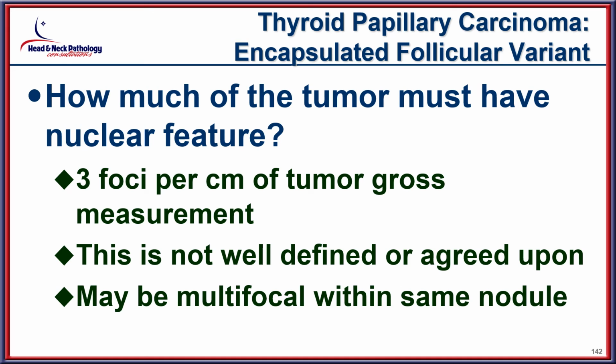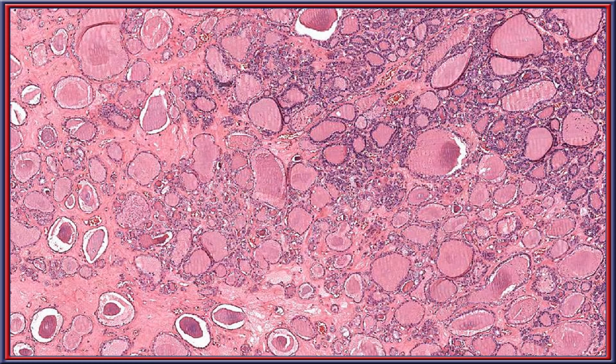And of course, it's all within the same single nodule, even though it may be multifocal or multicentric within that single nodule. So let me just highlight that particular feature for a moment. I think here you can see 2 different fields at low power. I'm going to go to each of them on high power.